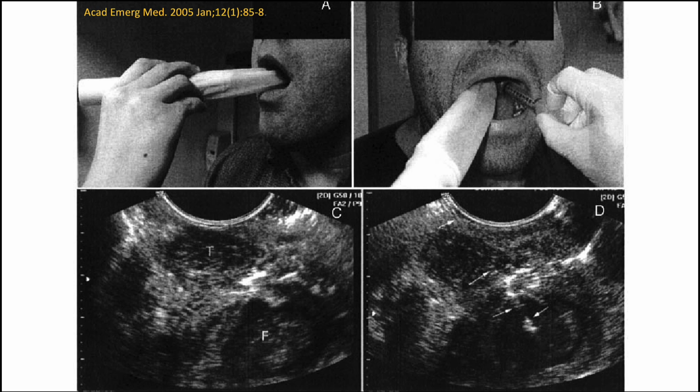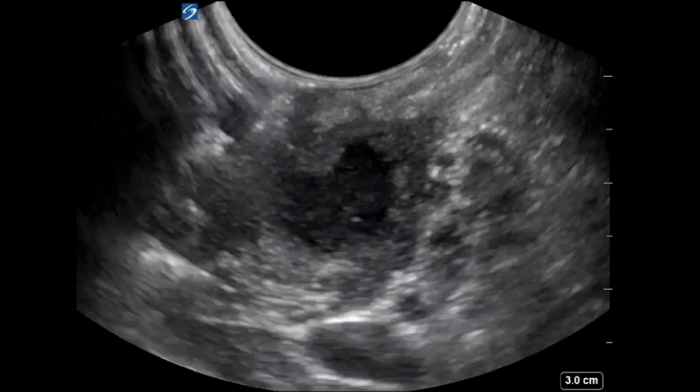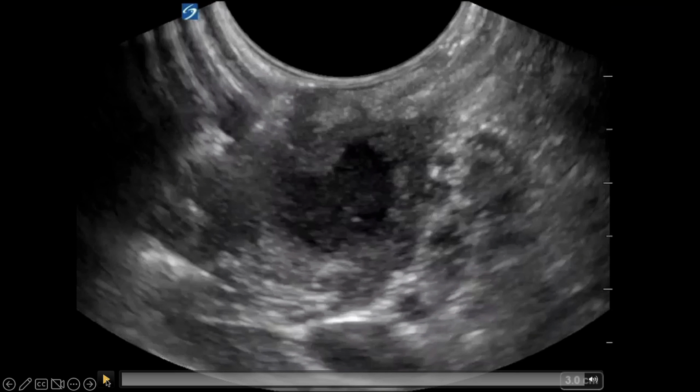Now, I'll take a little side tangent and say, almost any hospital where you work, there's probably an endocavitary probe somewhere. You just need to know how to get it. But that's a story for another day. But this is what I usually like to do, and you maybe have even seen some of my videos on YouTube. This is one of my favorites.